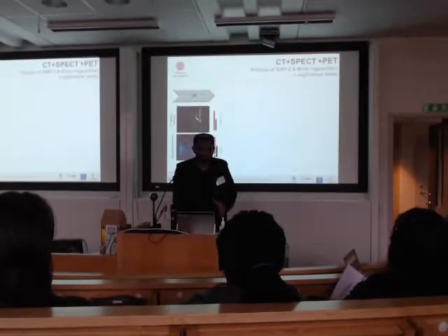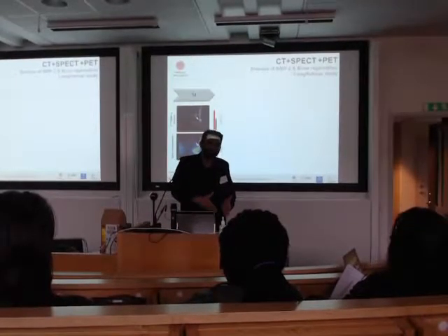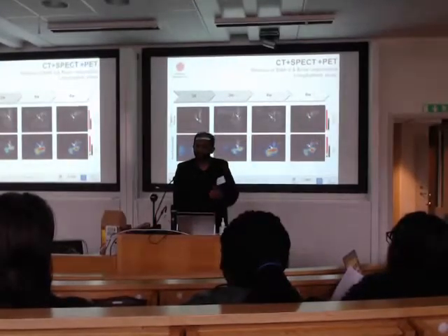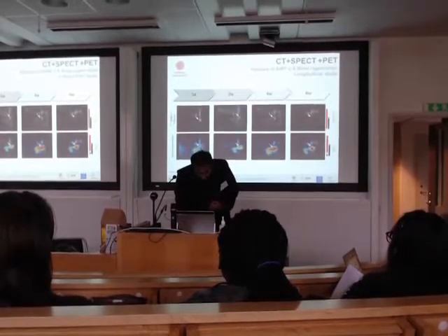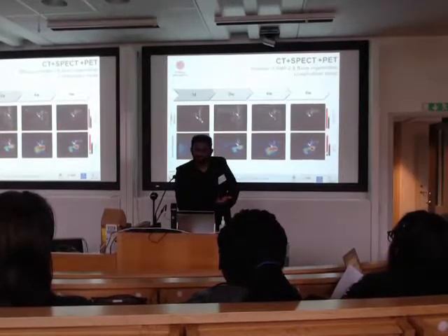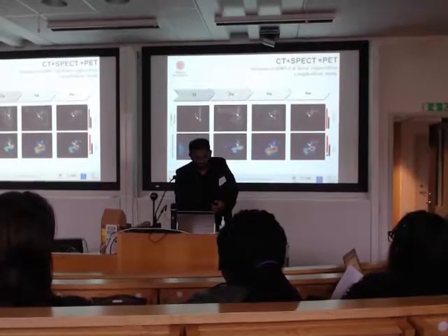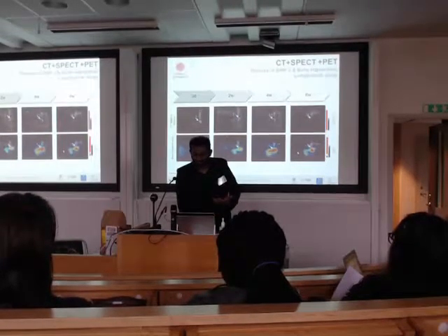This is 3 days post-injection. Then we did a longitudinal study. We performed the same procedure on the same animal at different time points, and this is how the profile looked. We followed the same animal 6 weeks post-surgery. As you can see, there is a release of, can I get the mouse? Yes. You can see there's a protein, and then it gets released into the stream. And with time, since there is a protein, you could see a response as bone regeneration. The rate of bone regeneration is getting faster and faster.